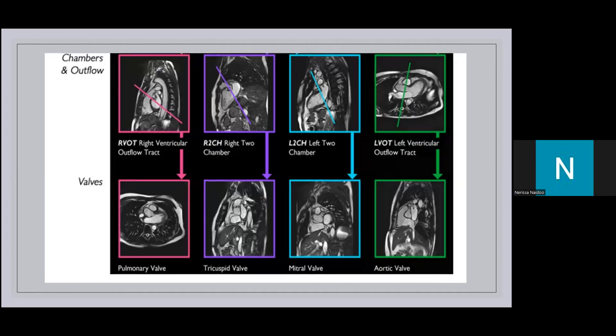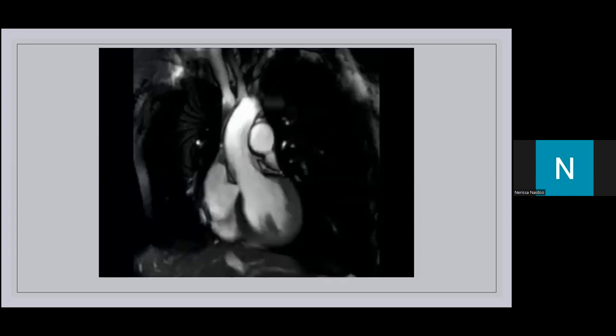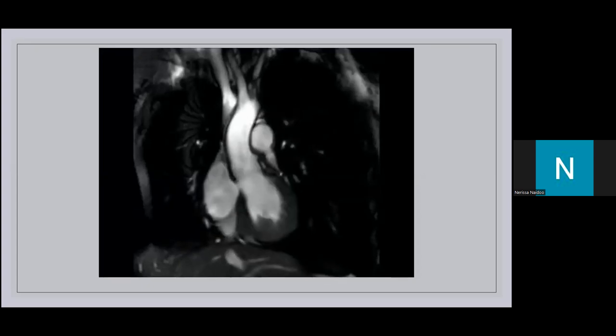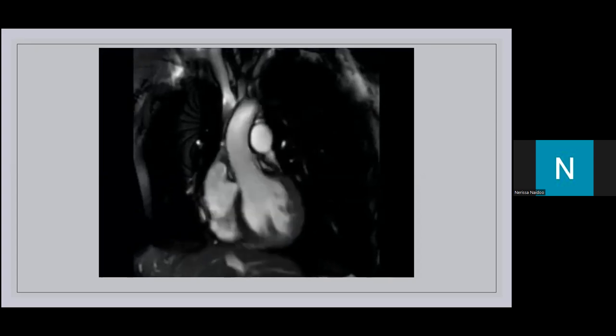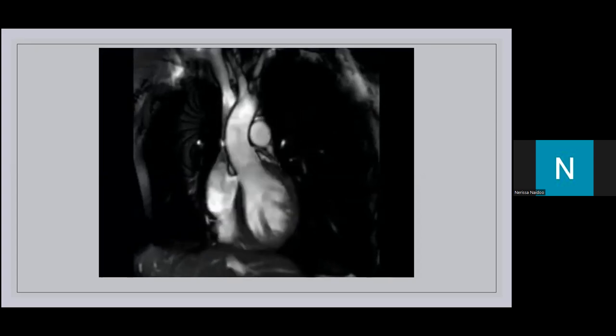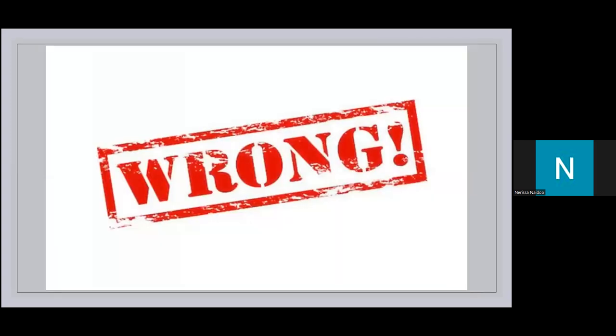But we want obviously something like this, something that we can visualize, watching the heart pumping, we can see the valve opening and closing. You are assessing wall motion abnormality, any obstruction to the flow, and obviously looking for any extra cardiac pathology. However, this is not always the case. It's not always that easy.